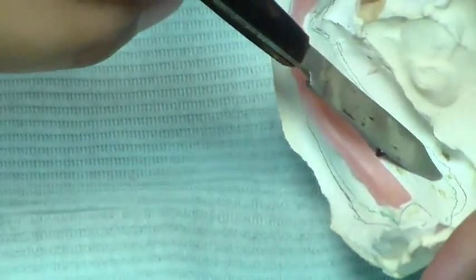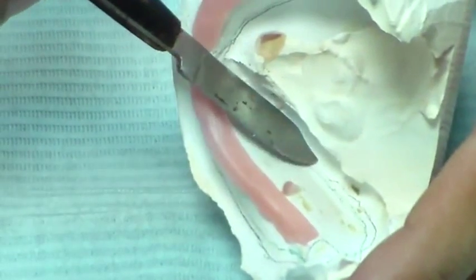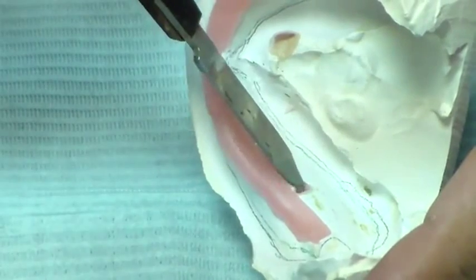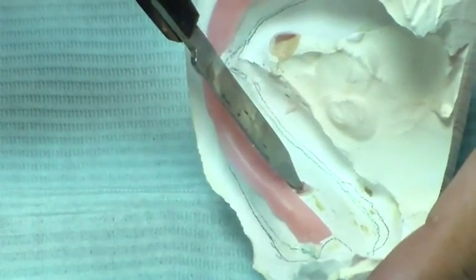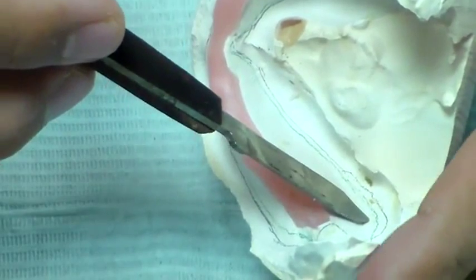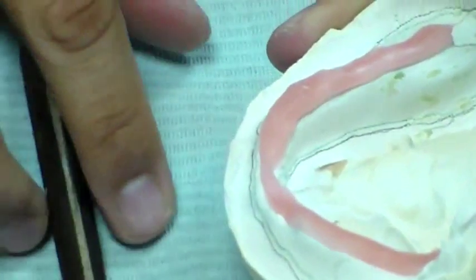This part needs to have a little block-out because there is a little undercut in this region. There is also an air bubble that I've tried to block off with wax. I'm going to add a little wax so it's blocked out on both sides, and then go ahead with the construction of my tray.